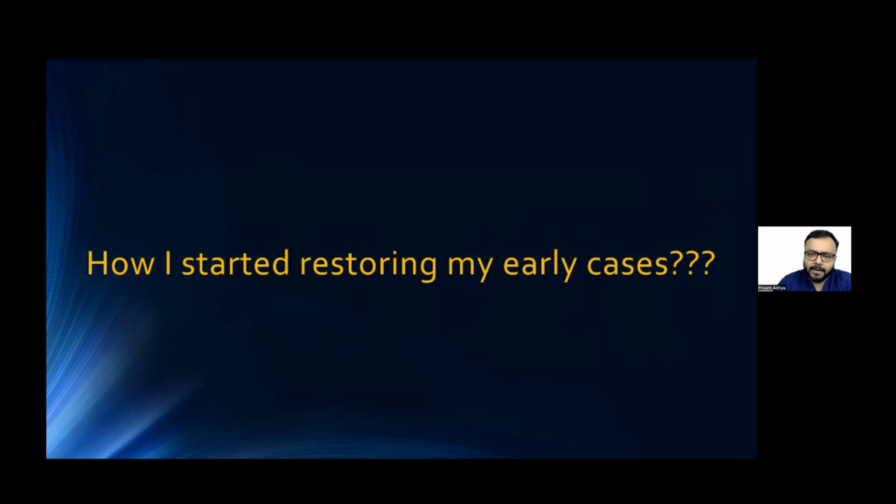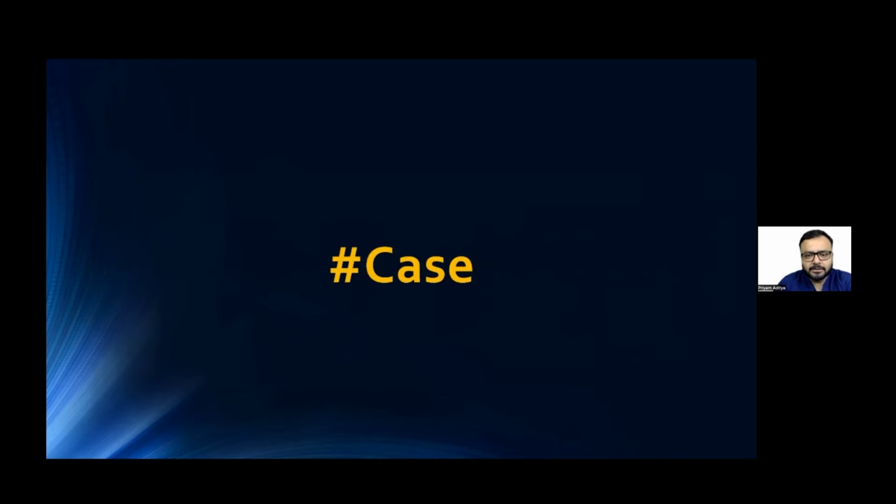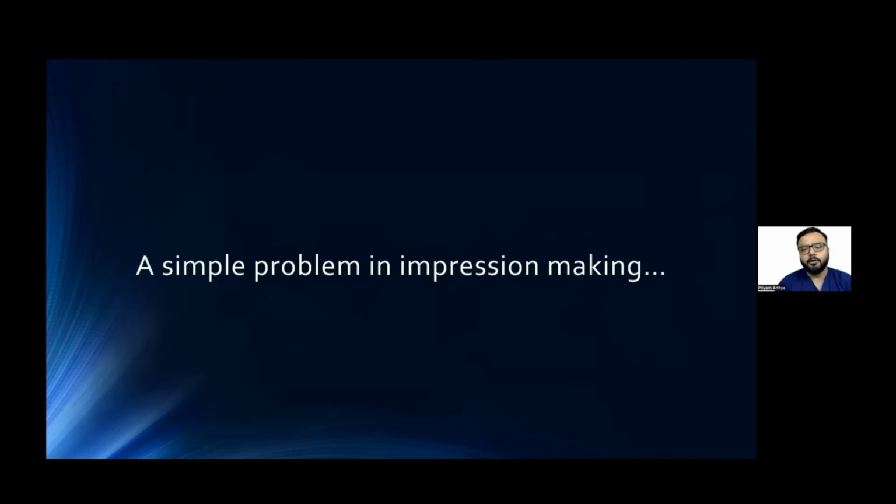When I was preparing this webinar, I was thinking what would be the best way to show how much I have changed my workflow. So I dug up a case which I had done almost 10 odd years back, and I'm sharing that with you. So this was a case where we had done a fixture level impression and a simple problem, and please understand it's a very important point that I'm making.